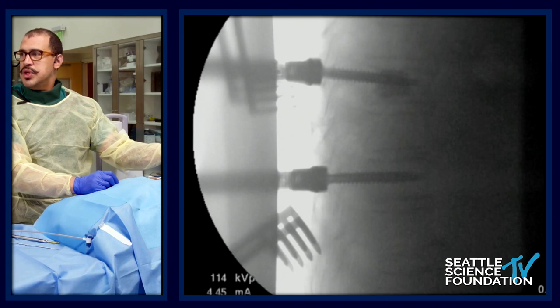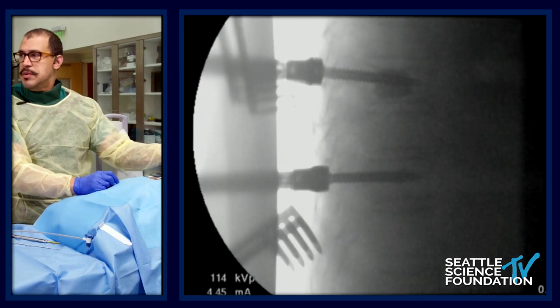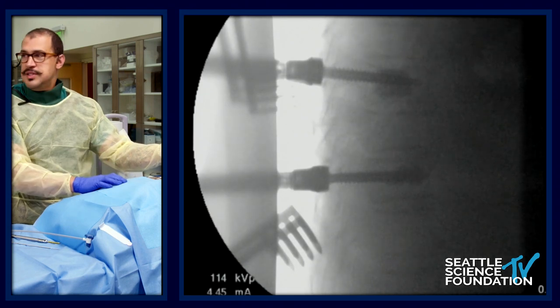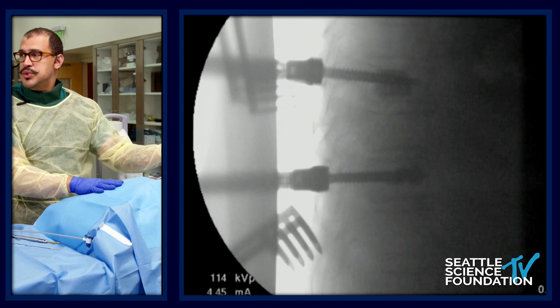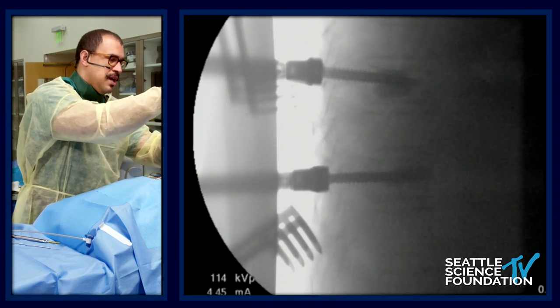We're at our bottom screw now. Nice and slow so that if we start to see extravasation, we're able to stop. That looks great, and I'm going to come to my right-sided screw.